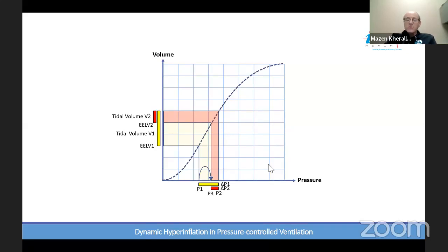And of course, I would not do it for a patient. It's not going to make much difference between 7.5 and 8. It's a little bit of increased resistance because of that difference in the size of the tube. But yes, the larger the tube, the lower the artificial resistance added to the circuit, but you don't affect what's happening at the alveolar level. Lovely, thank you very much.